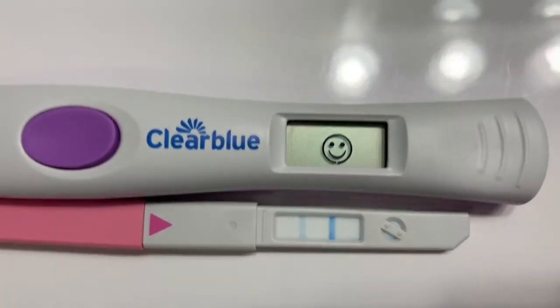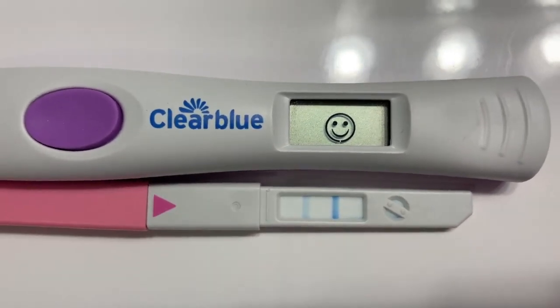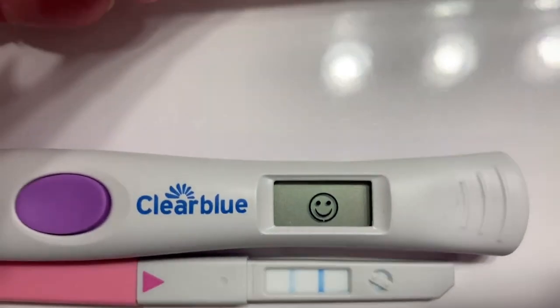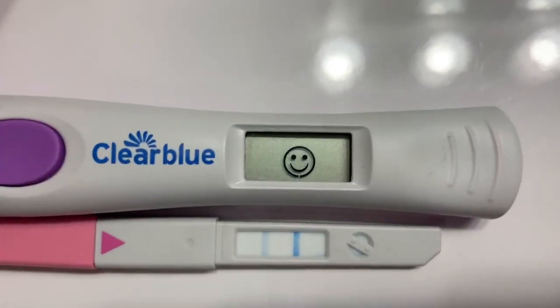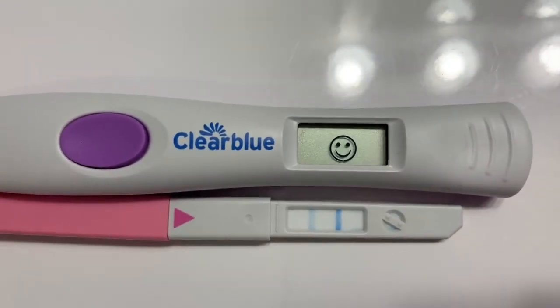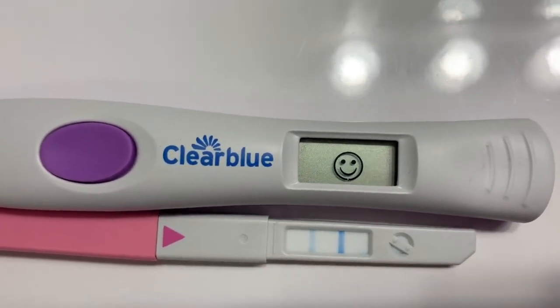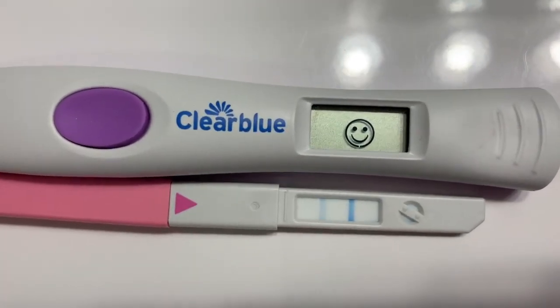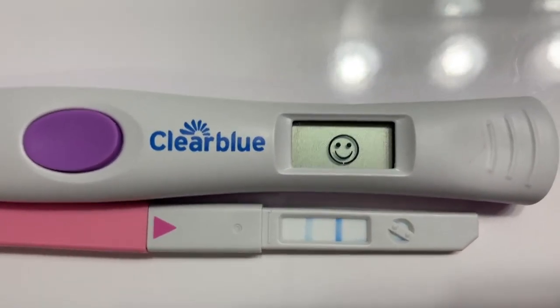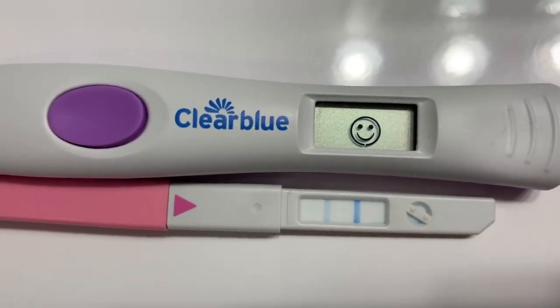I'm not going to turn the camera on myself. I'm just going to say this, and then we'll go to tomorrow. I was not going to test tonight, and I was going to let it go until 1 p.m. tomorrow. Maybe I was going to test at 10 a.m., just because the closer I get to my expected ovulation or surge date, the more I randomly test throughout the day. And this was just random, that I thought, oh, I'll just go ahead and test tonight. Yeah, glad I did, because I need to inseminate tonight.